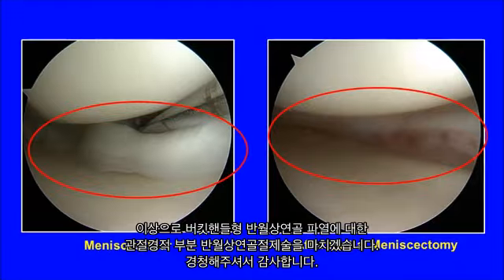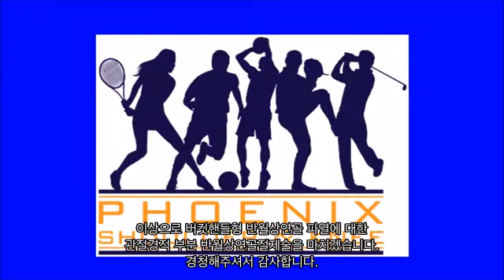This concludes arthroscopic partial meniscectomy of a bucket handle meniscus tear. Thank you for your attention.